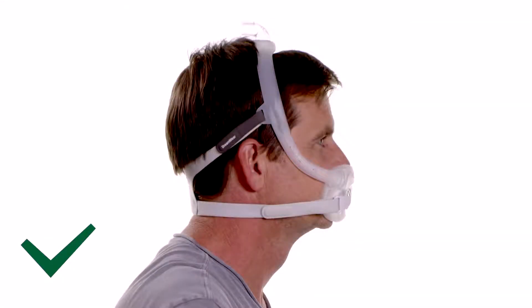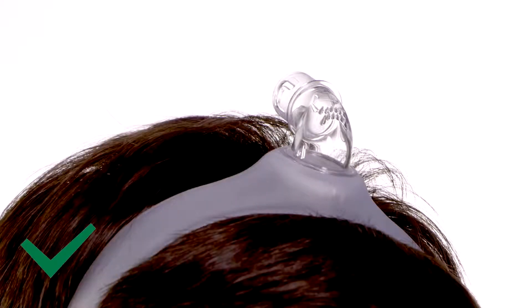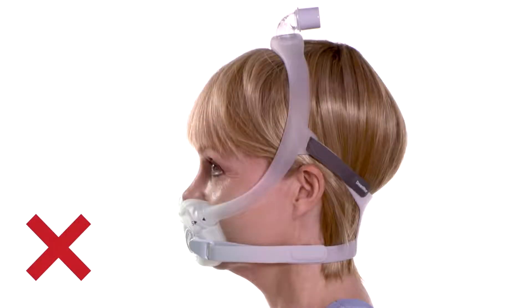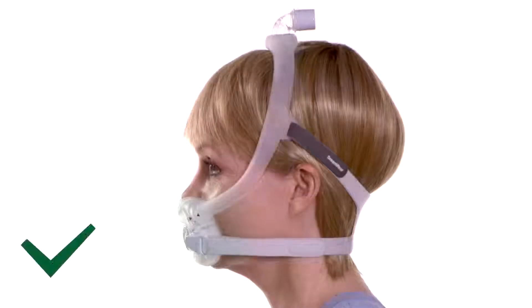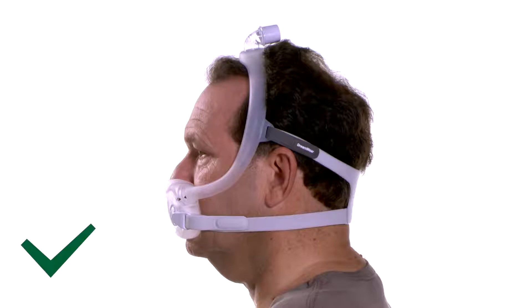When seated correctly, the frame will rest between the eye and ear. The elbow will be positioned at the top of the head. The mask frame should not fall back close to the ears — if it does, try a smaller frame. If the frame falls forward close to the eyes, try a larger frame.